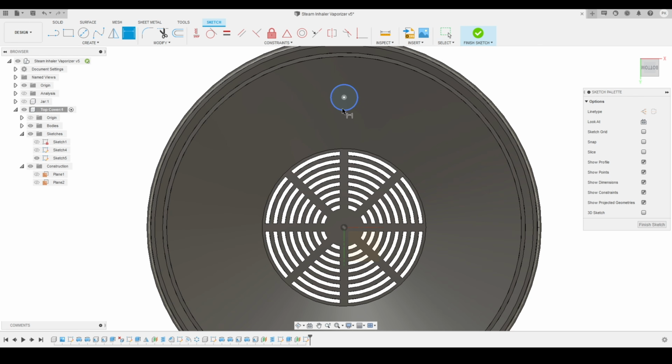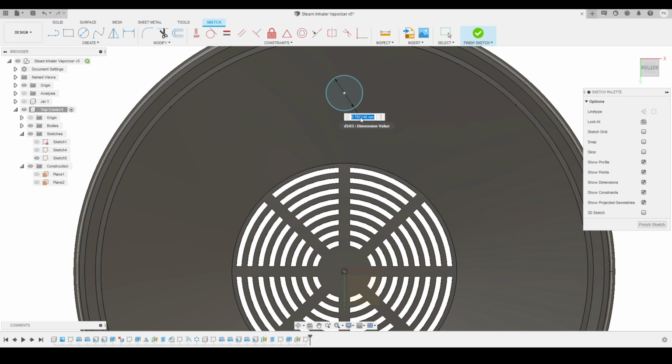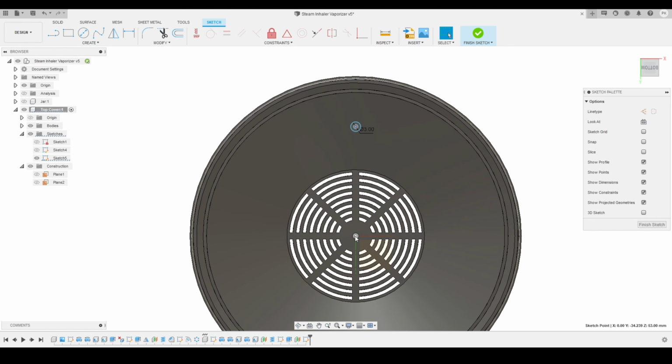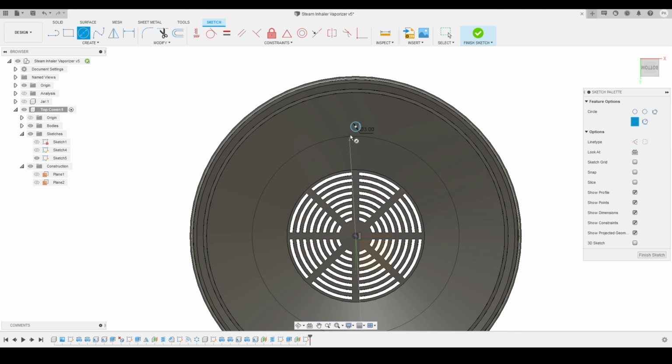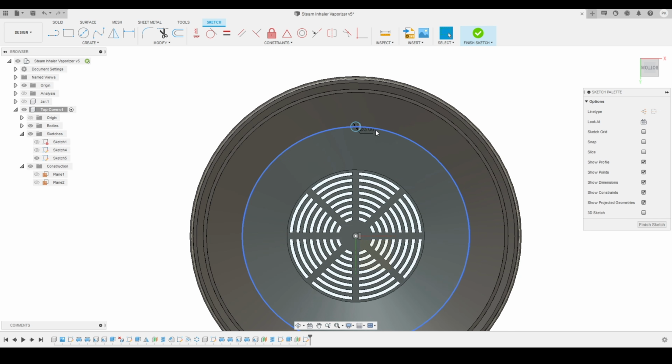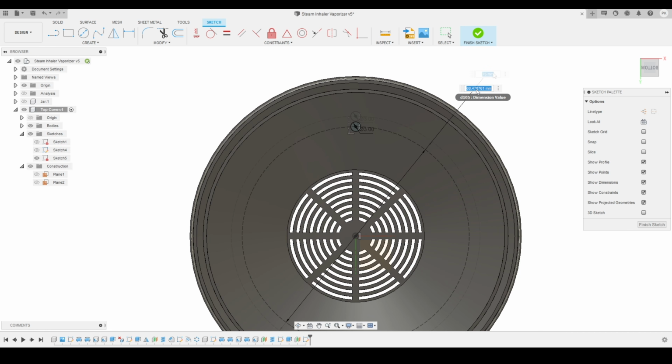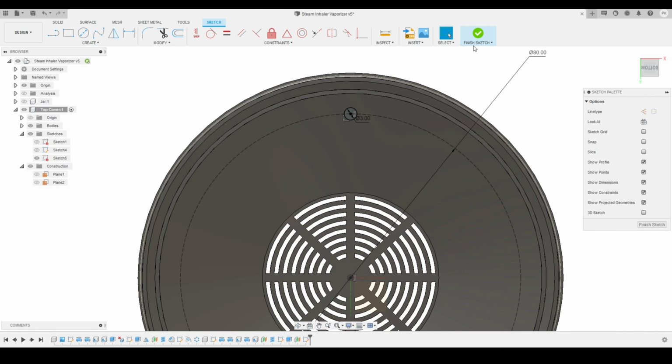Now I'm going to define this circle. So this one is just 3 millimeters. Here you can see I have defined the circle using the dimension tool, and I will select both the origin and make sure that both are in the same vertical position. Now I will create one more circle, make sure that it is touching the other circle's center, and make sure that it is a construction line. Here you can see. Now I will define this circle diameter. So this one I want to keep maybe 80 millimeters, which will be a good choice because I just want to locate the hole at a good position.